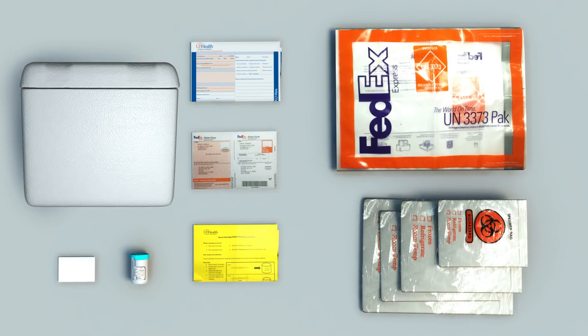Muscle biopsies allow our neuropathologists to diagnose muscle disorders and actively support the neurology and rheumatology community at large by providing finely tuned, comprehensive diagnostics. Our muscle kits are streamlined to provide a minimalistic approach for our submitters, which in turn reduces turnaround time and improves patient care.